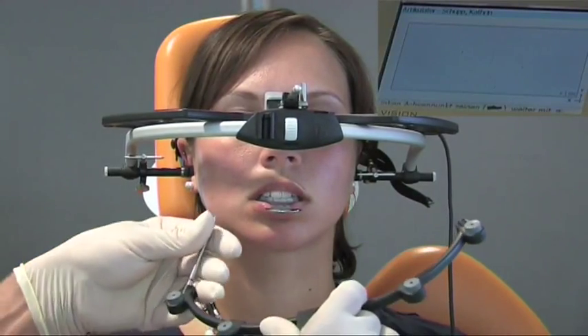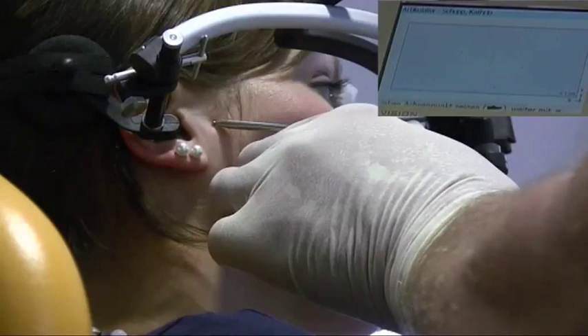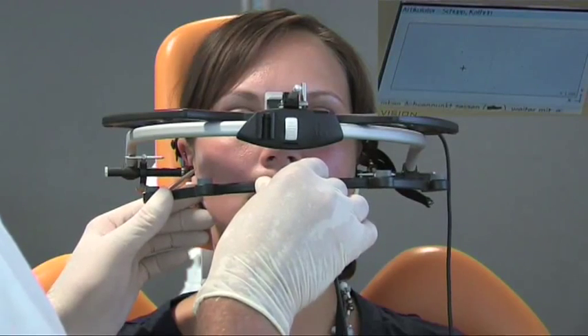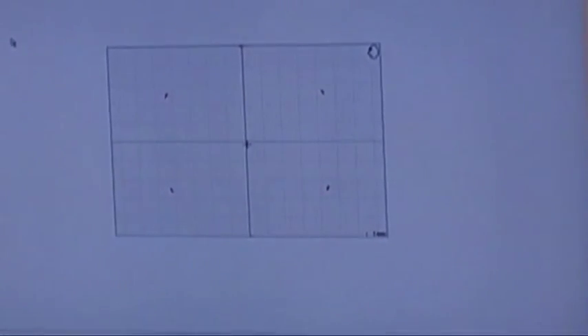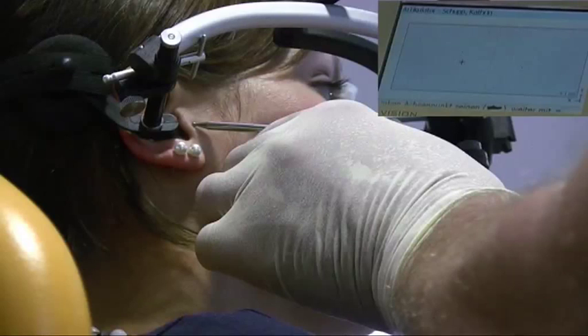The indicator pin is inserted on the right side of the bow, and measuring is started once again. During ongoing measuring, the pointer is aligned under optical and acoustic control to the hinge axis point. In the DIGMA display, the actual position of the pointer is shown, which has to be guided to the middle of the axis cross.